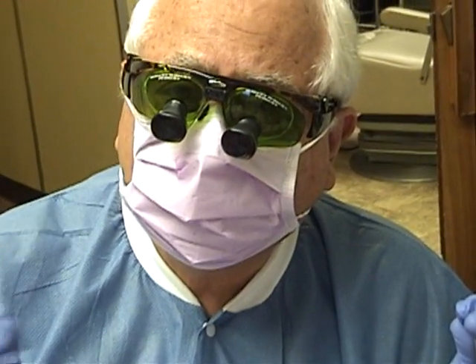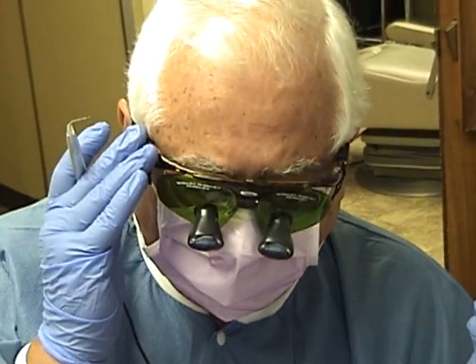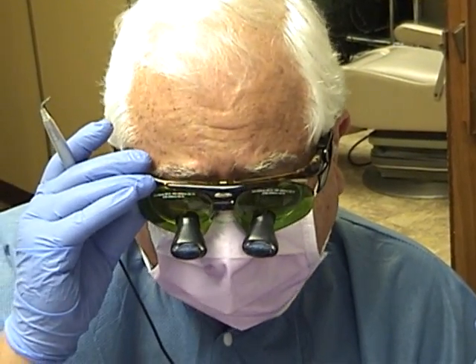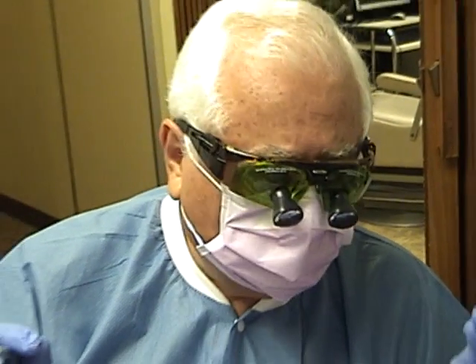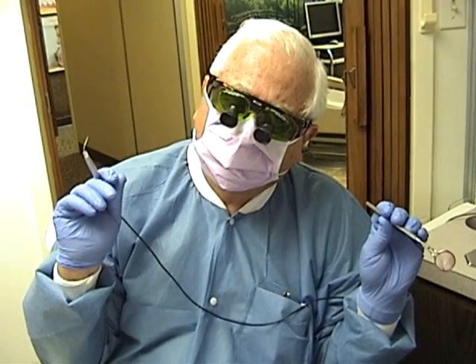We have our precautions. I'm wearing a high filtration mask. Everybody in the room, including John, has these green glasses on — I have mine with little magnifying loops. Normally I have a light, but the light would block off the video. For safety reasons, we also have to have a high speed suction and a sign on the door so nobody else comes in.